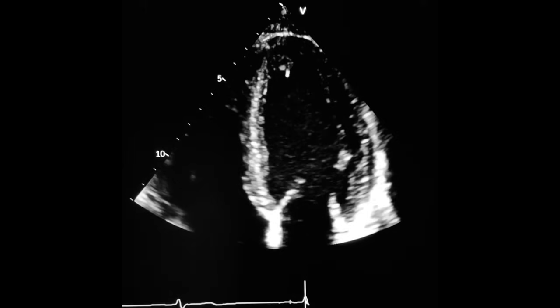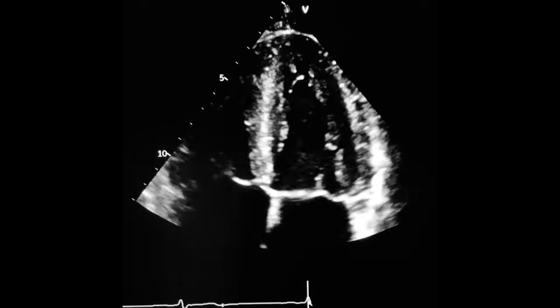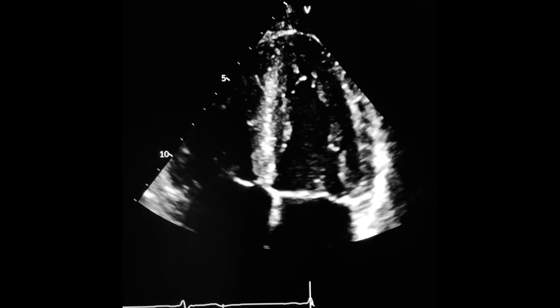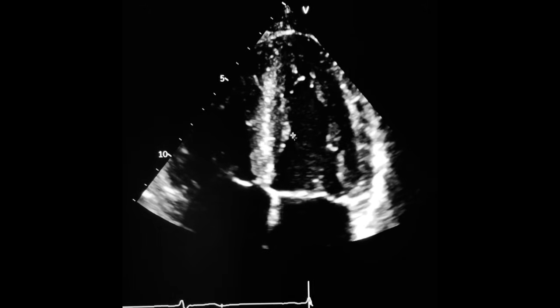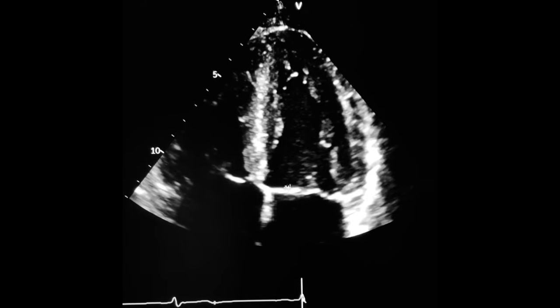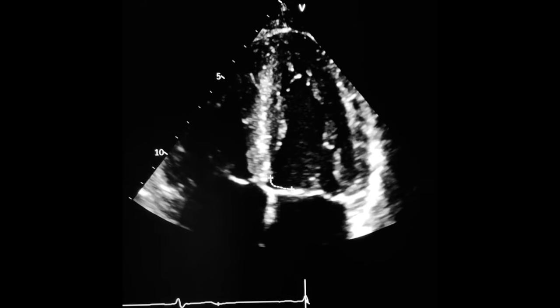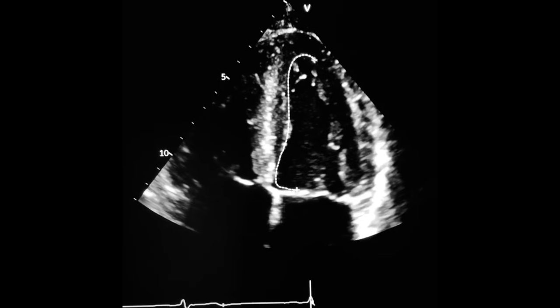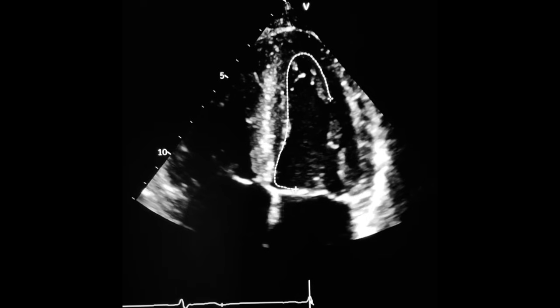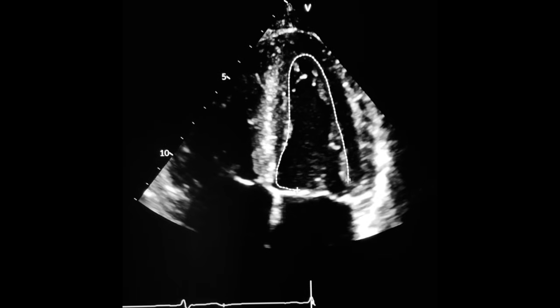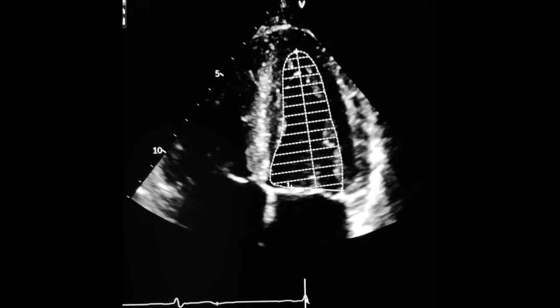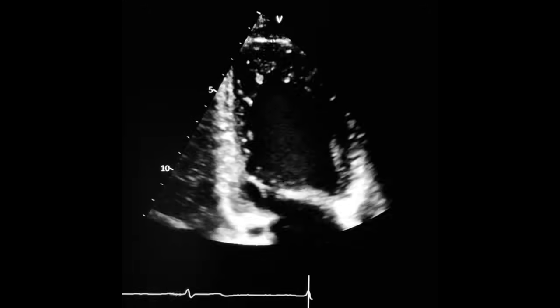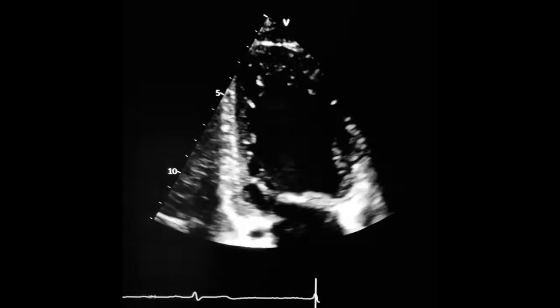Now, we have to do the same but at the end of systole. Freeze the image at the end of systole and trace around all the endocardial border to get the end-systolic volume. One plane is done, so let's do the same in the apical two-chamber view.